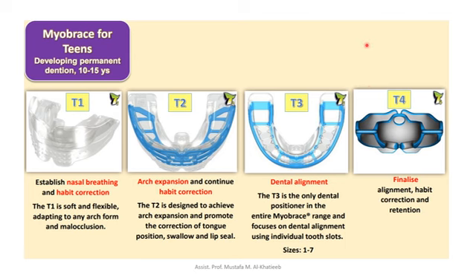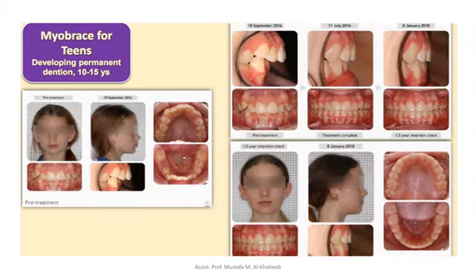For the developing dentition, as we said, this is another case, not belonging to me. Also ending with normal overjet and overbite.